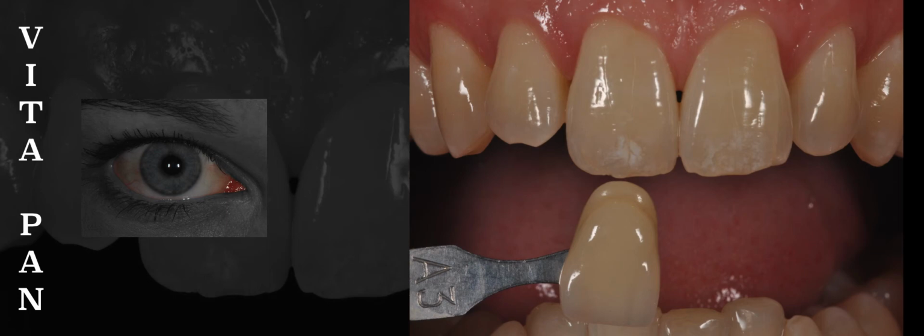Now, you select the tab and compare it to the tooth. Here is where many dentists make a mistake. Look at the photo and tell me, which portion of the tab am I using to try to select the shade? Is this correct? No, it's not.